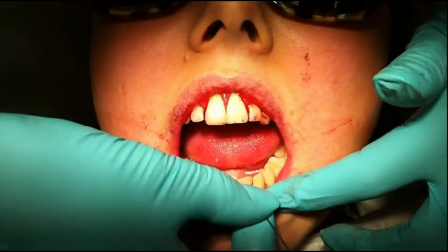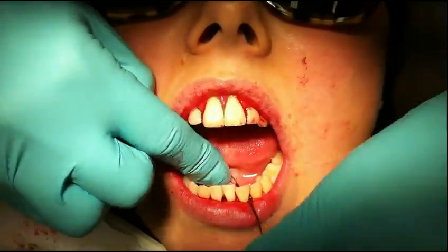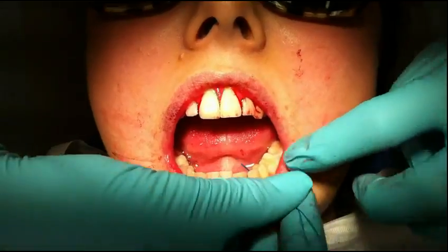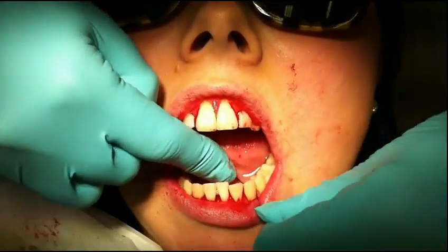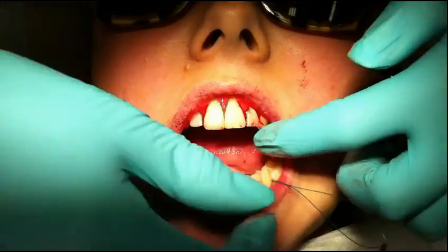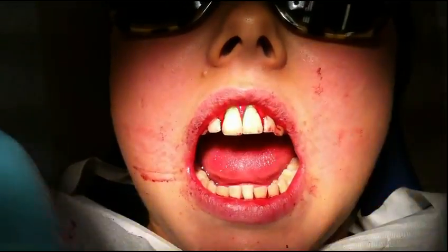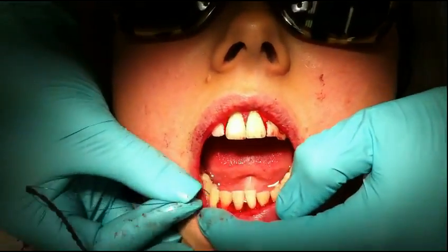What I often advise patients at this stage is to avoid using the floss when you're in a hurry, because it takes a bit of practice.